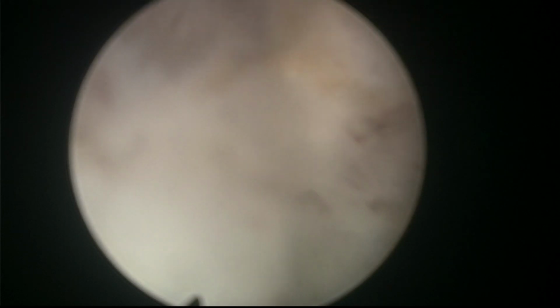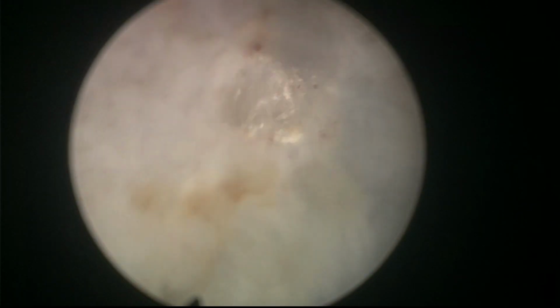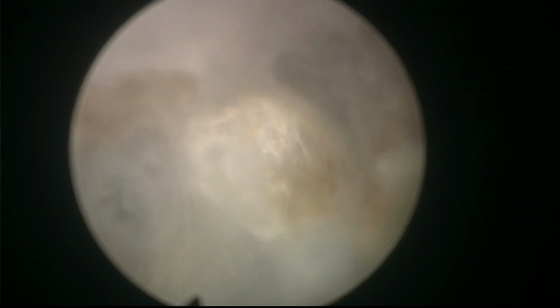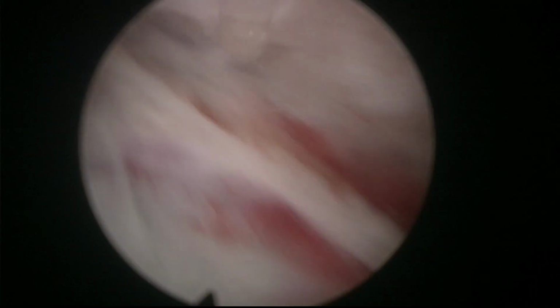Okay, so let's check what happens with our line of attack from the side, looking at the side, coming a little bit more anteriorly, crossing over to the other side posteriorly. Look at the beautiful hemostasis we get. The nice thing of pulse modulation, the aspect I like more, is that you get pretty good hemostasis. This is probably the area where we were dissecting mechanically.